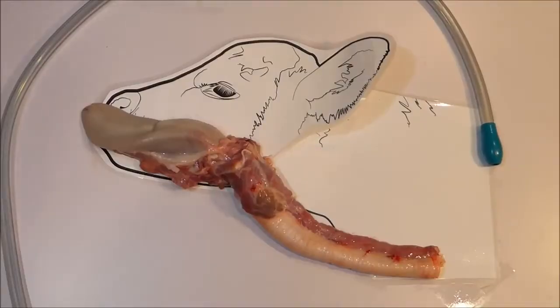So that is our first point. Gentle handling, gentle hands and not forcing the nose up will ensure the tube avoids the airway.